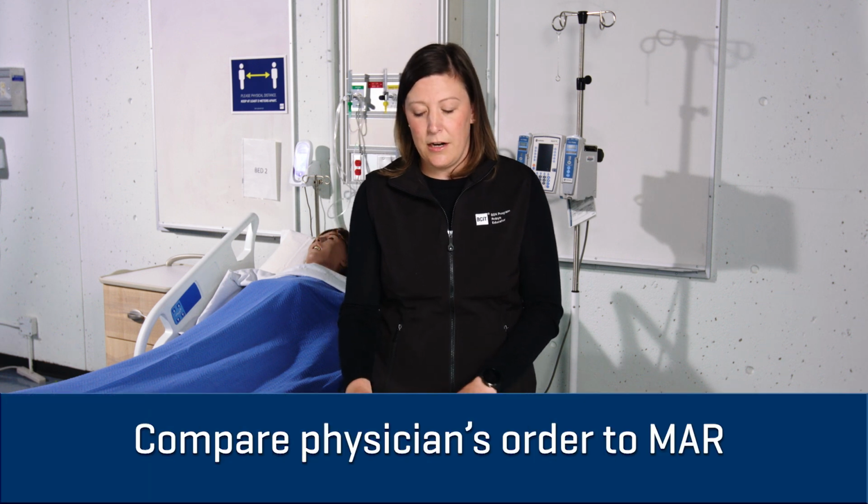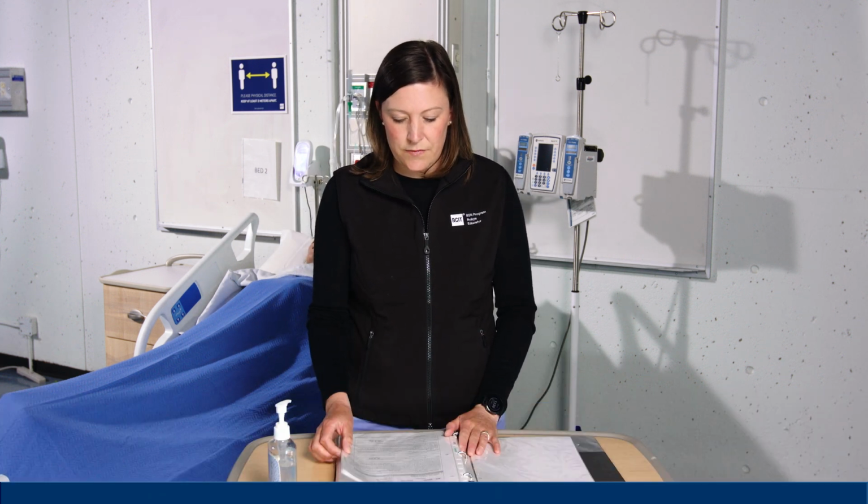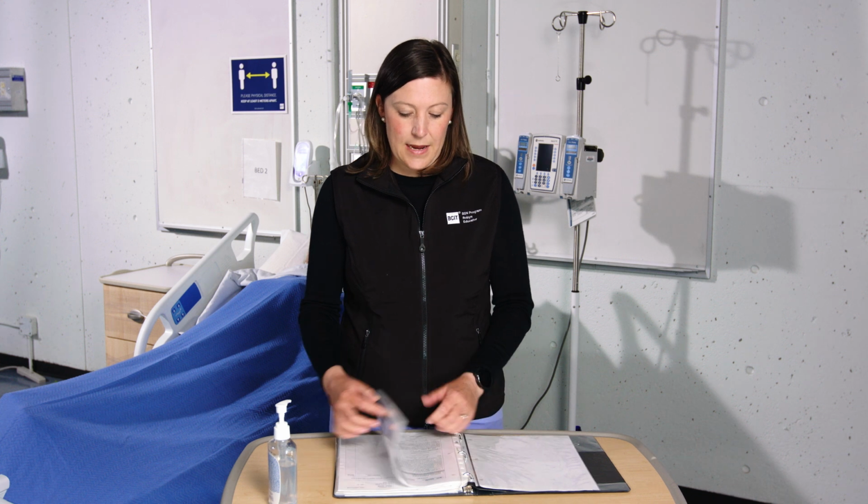I have just washed my hands and assessed my patient. I noticed during my gas exchange assessment that Mrs. Jones was complaining of shortness of breath and had expiratory wheezes, so I feel that she would benefit from a PRN bronchodilator. So I'm just going to come over to my MAR here and check and see what she has ordered. I can see she has a doctor's order for salbutamol, PRN.